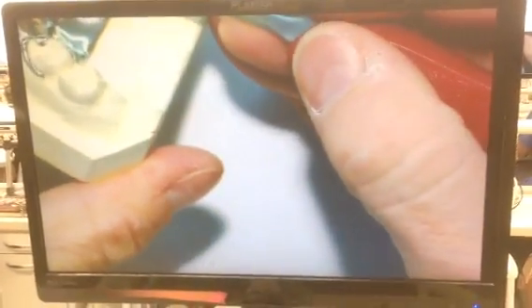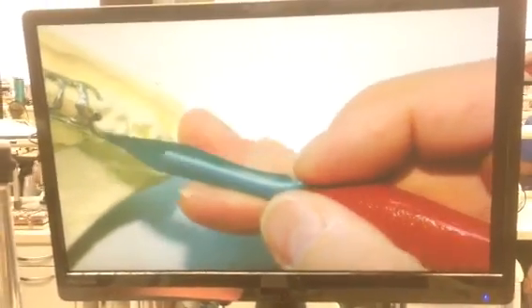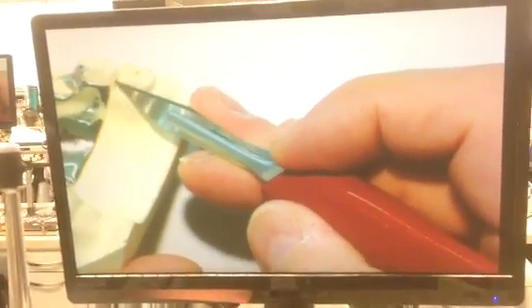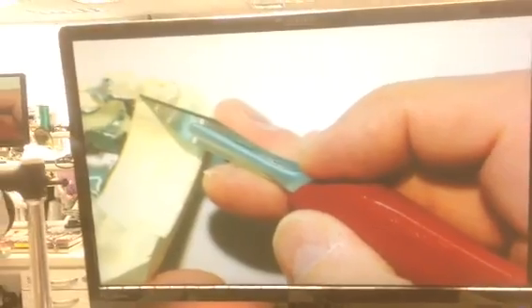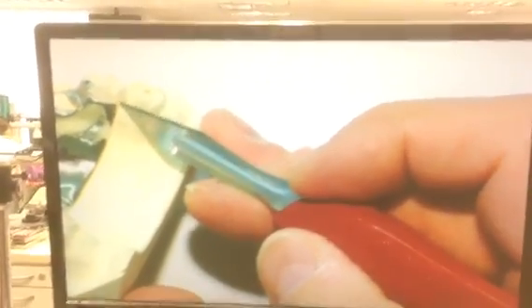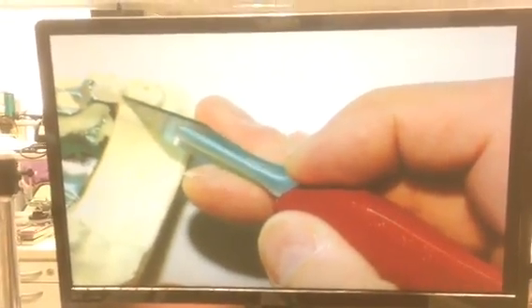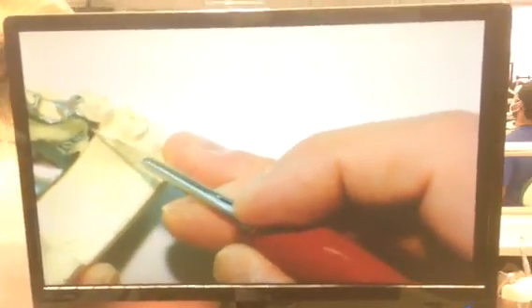When you draw this lingual plate, remember we want 180-degree encirclement of this tooth. So you want to draw that lingual plate back as far as you can without crossing the line angle back here, so you get good encirclement of that tooth. Your plate should be at or above the height of contour and not interfering with the plane of occlusion. Okay? This is providing your reciprocation.